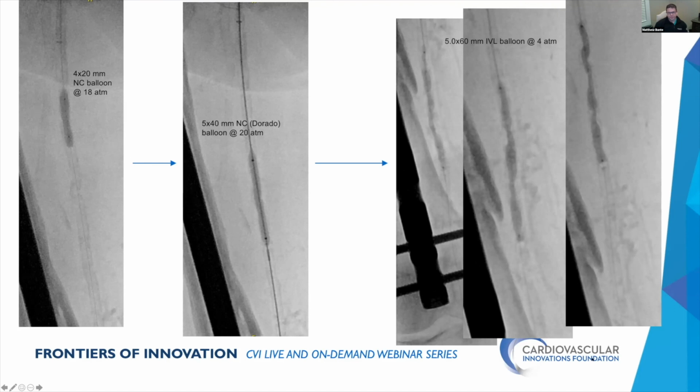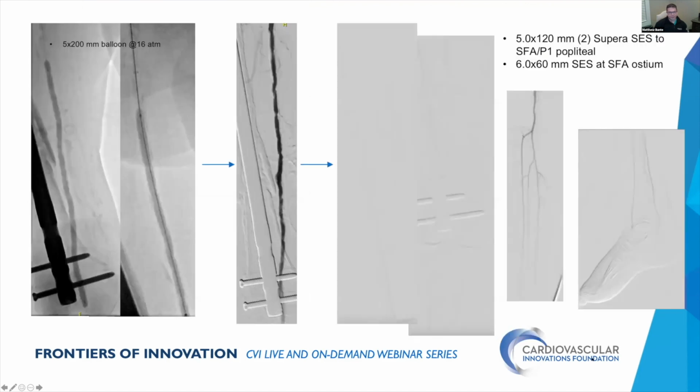Tragically, her femur really got destroyed in a fracture. So that was pretty dramatic to look at throughout the case. And of course, it increased my radiation dose with that big nail in the femur.